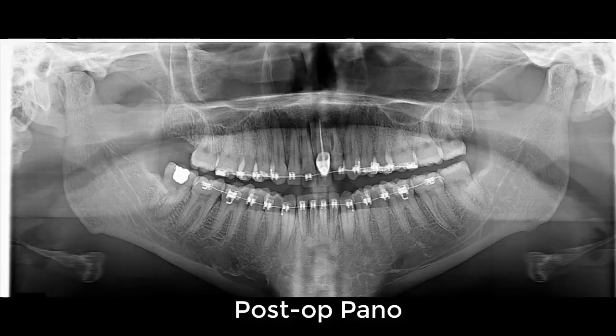Here's a post-operative panoramic radiograph showing great repositioning of that segment and in perfect alignment with the adjacent teeth.